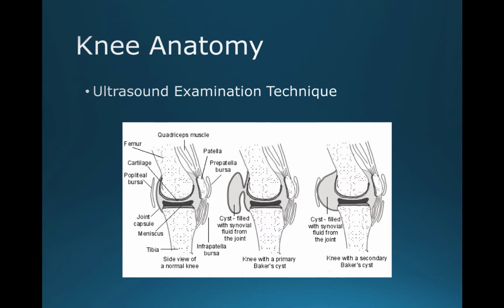The most common place to get a knee effusion is in the suprapatellar recess, or the suprapatellar bursa, right in this area. A Baker's cyst is right here, which is a cyst-filled area behind the knee, which you can get an outpouching of if there's meniscal degeneration. Here's a large Baker's cyst, and then here's joint fluid distension right here.